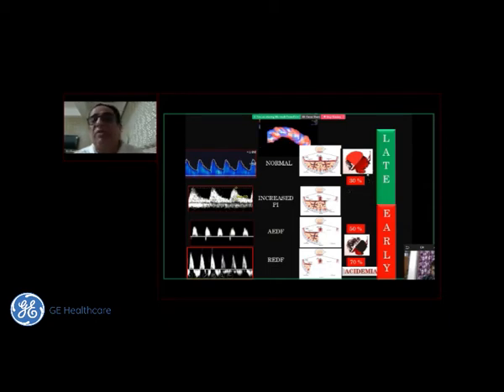So till the placenta is about 30% deficient in chorionic villi, you may see normal umbilical artery flow. And these babies, although having poor blood supply, may not present as FGR in the early part of pregnancy. And therefore, they can present in the late part of pregnancy as FGR when the demand of the fetus increases, and this group then manifests as late FGR.